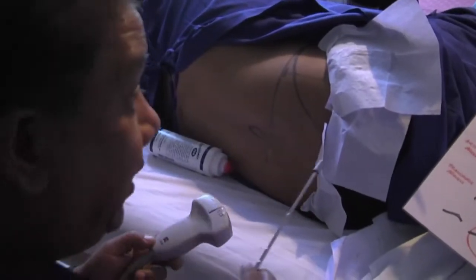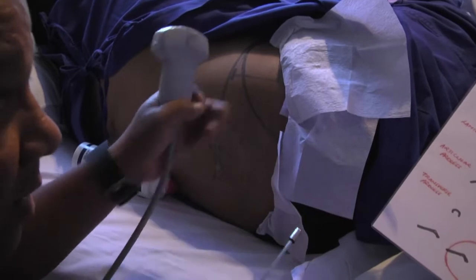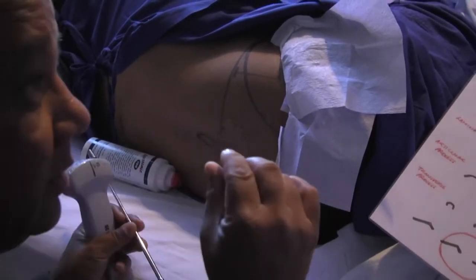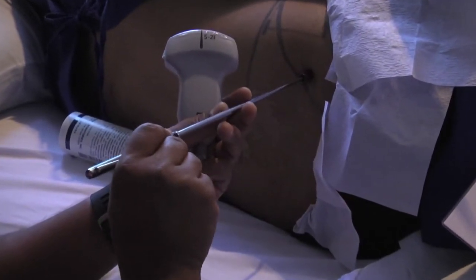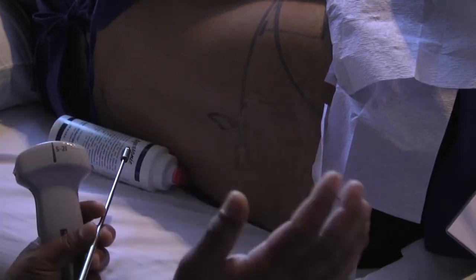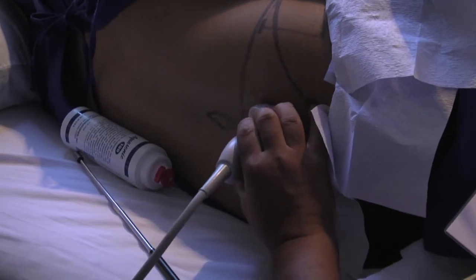Now, sometimes putting the mark, I give you a tip, don't tell anybody. When you put your mark here, that mark will disappear because these are all washable markers. You know, you have the needles, the cap of the needle, yeah? So throw the needle away, take the cap and just press it on the skin and just rotate it like this a few times. It leaves a mark there. So that's a very good mark. Even after you clean with alcohol, spirit, it stays there for some time, but it disappears before he goes home. So it's a good marker.